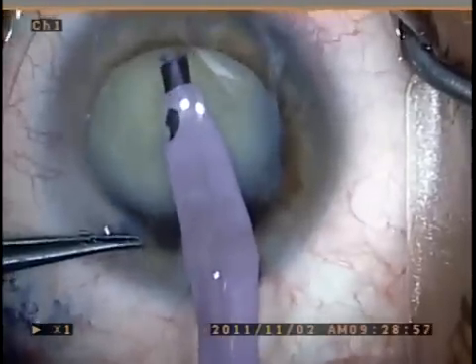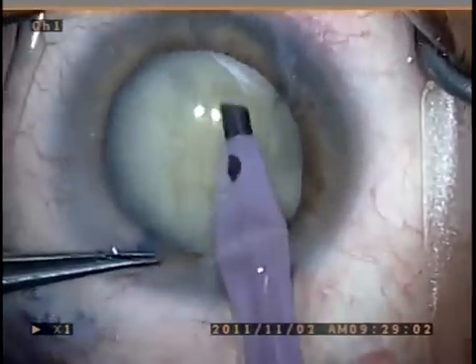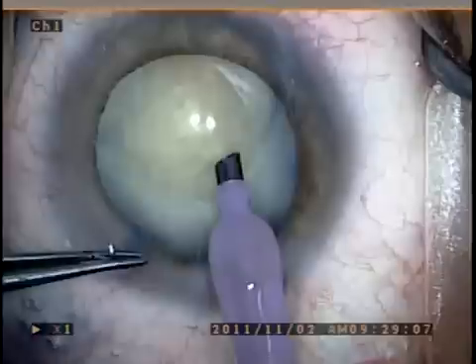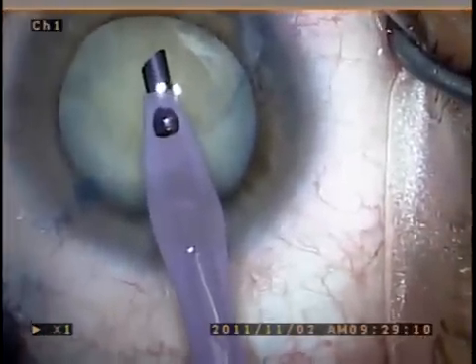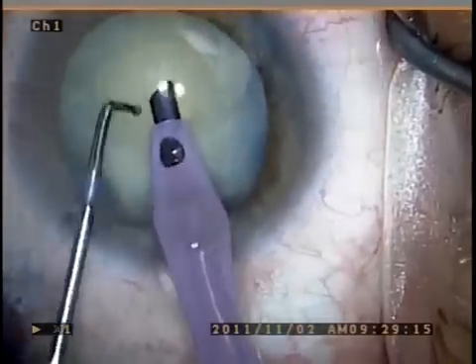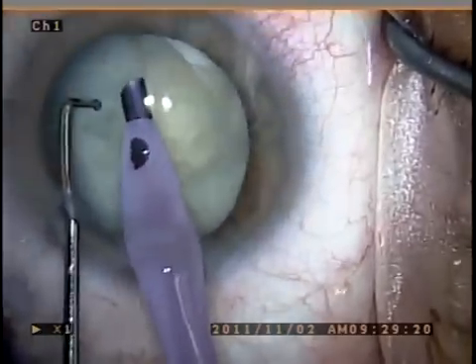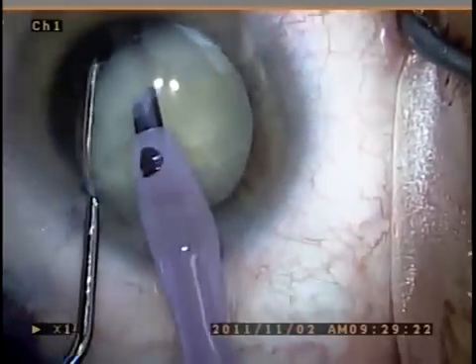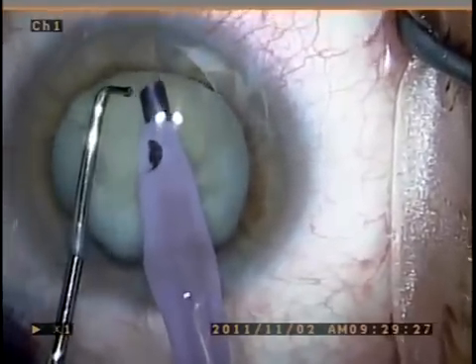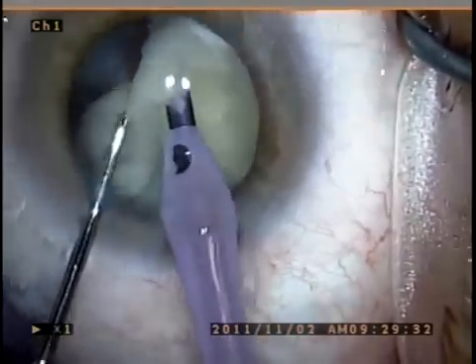You can see that the lens is quite dense, and I'm whittling away with the phaco instrument. Then we go from a vacuum setting of 60 with an aspiration of 20 to a higher vacuum setting, roughly 400 millimeters of mercury, and an aspiration flow rate of 35 cc per minute.